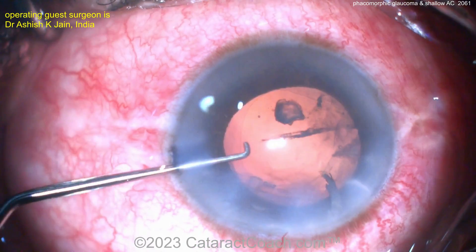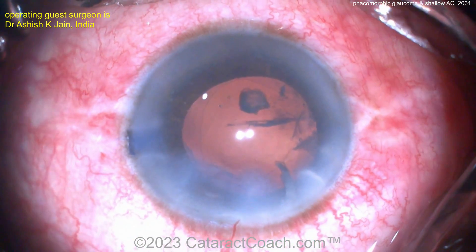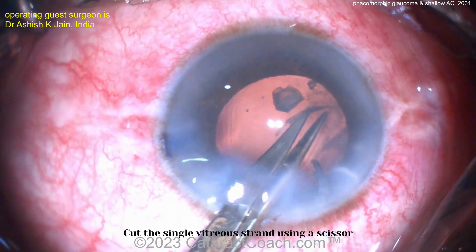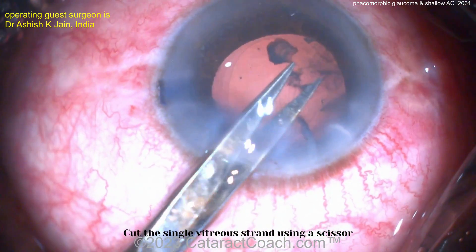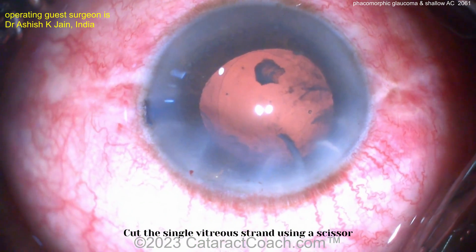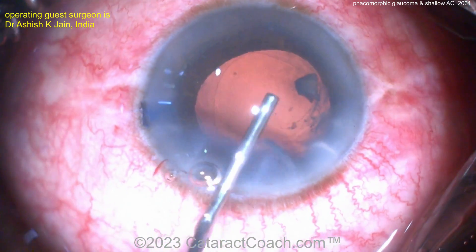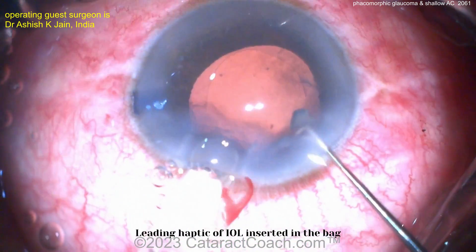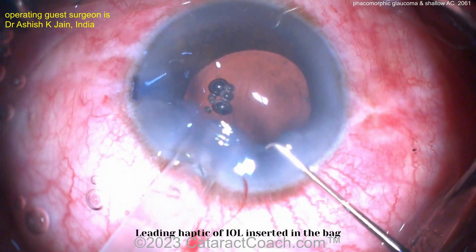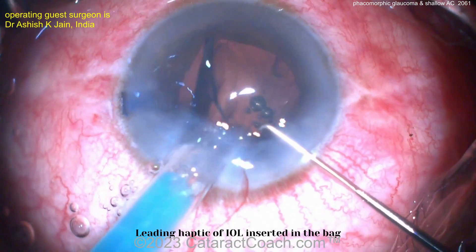A couple of little pieces left — maybe a little strand of vitreous there. Cut it with scissors; you can definitely do that. I definitely want to put some triamcinolone on here to get some staining and see how much vitreous there is. If you just have one little strand coming around the area of zonodialysis, you can just put the micro scissors in the eye and amputate that one little arm or tongue of vitreous.